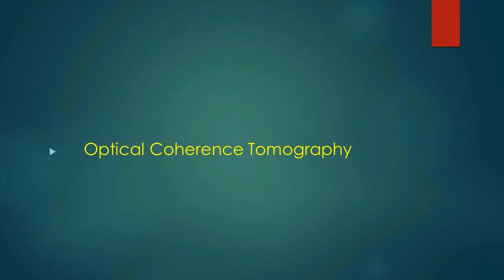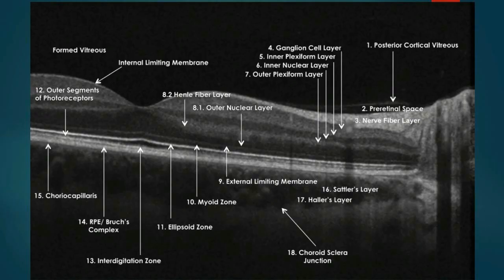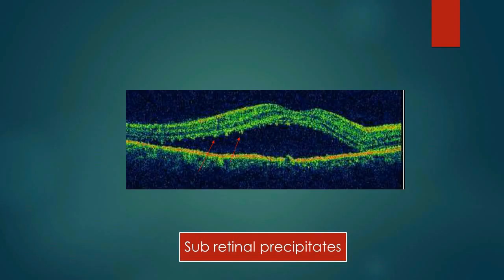Next is optical coherence tomography, which gives near histological-level cross-section of the retinal layers. It is very useful in various retinal disorders — for example, in this case of CSR you can clearly see the subretinal fluid.